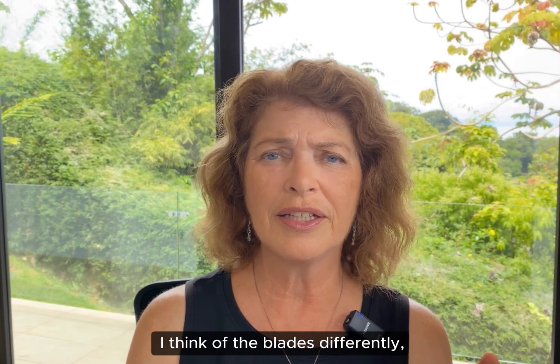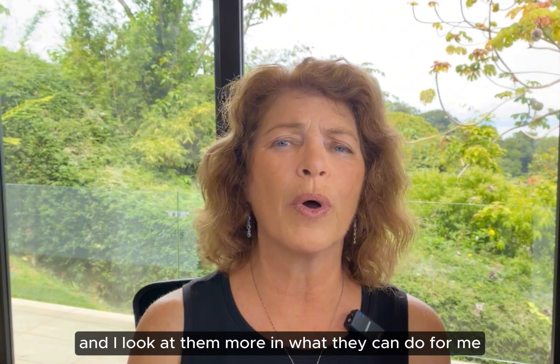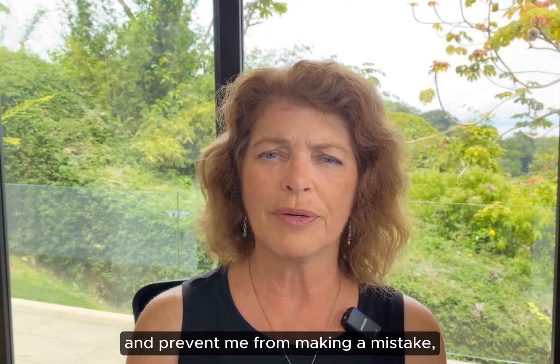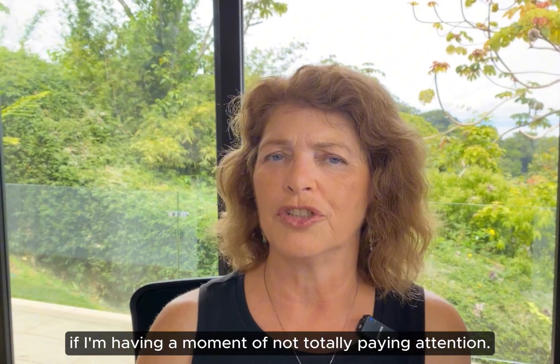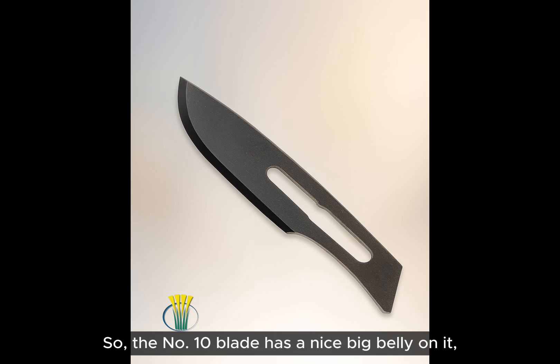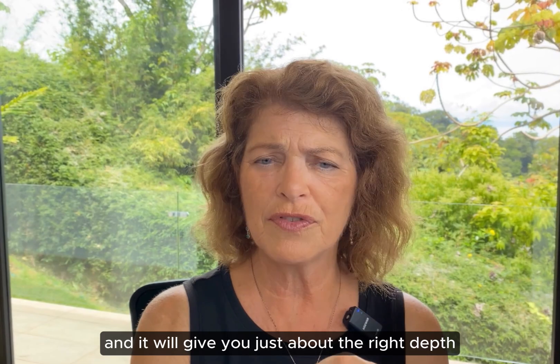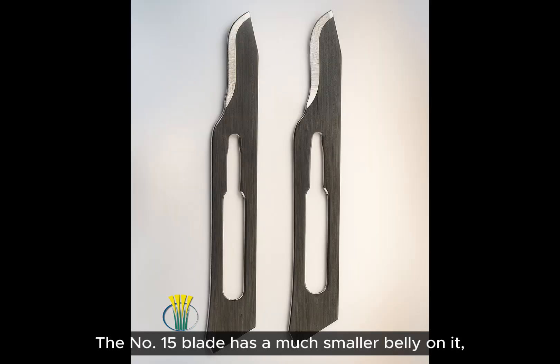Having said all that, I think of the blades differently and I look at them more in terms of what they can do for me and how they can make my job easier and prevent me from making a mistake if I'm having a moment of not totally paying attention. The number 10 blade has a nice big belly on it and it is great for making a long incision because you have a long cutting surface on the number 10 blade and it will give you just about the right depth for that long incision as well.